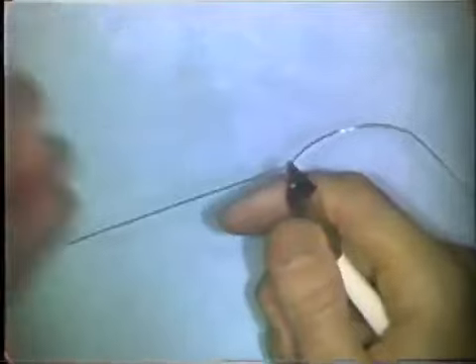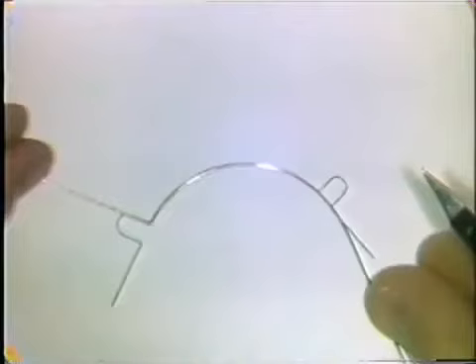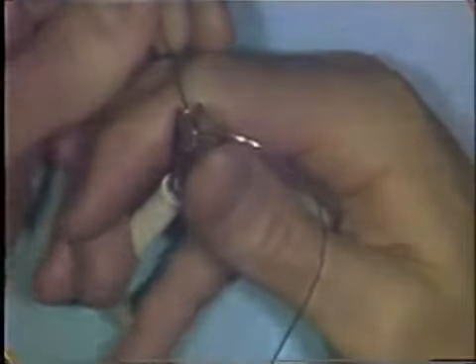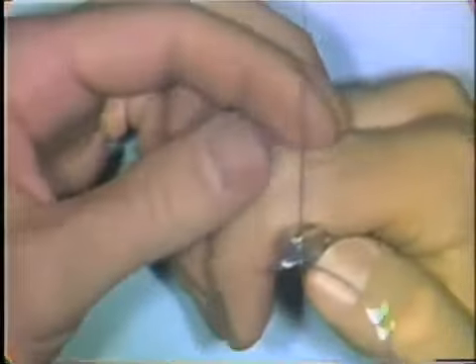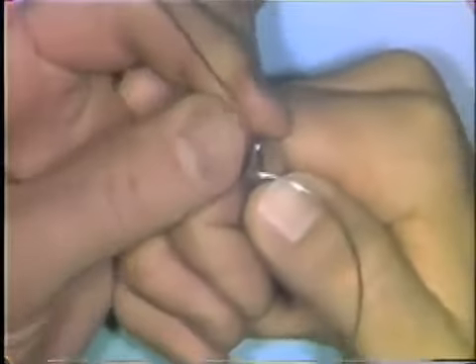You place the wire back in the plier beaks, orient it correctly, and increase the bend. You try the wire back on the pattern at this point, and if you're satisfied with the bend, you mark the wire at the point where the curve of the loop begins. You place the wire back in the pliers and begin to form the loop by placing the wire up in the larger round portion of the round beak of the plier. Start the first bend directly over the mark that you made in the wire. And with a series of small bends, form the loop.